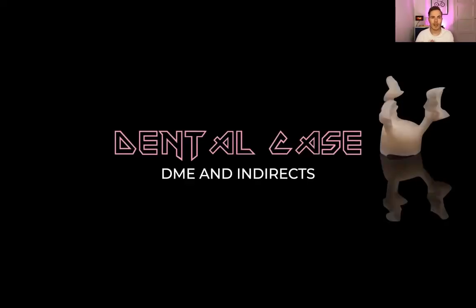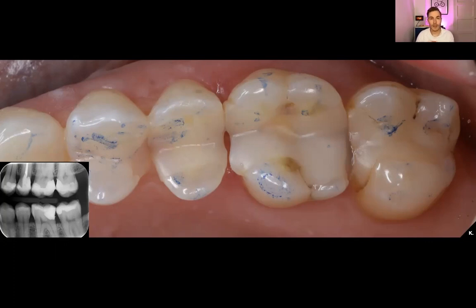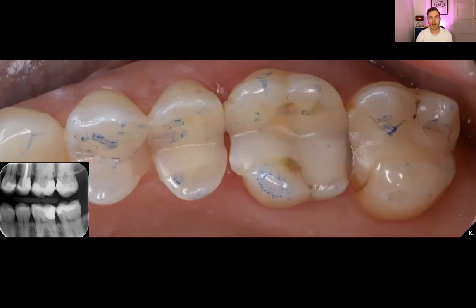Let's talk about deep margin elevation and indirect restorations. This is the initial situation of this case and as you can see there are some failing composite restorations. On the lower left you can see the bite wing and on the radiograph you can see that there are some leaking margins on the second molar and the first molar. Looking at the pre-op photograph intraorally, the restorations don't have the desired curvature and not the desired contact point. This patient was complaining a lot about irritated gums and food impaction, so we decided to remove the restorations and see what was underneath.